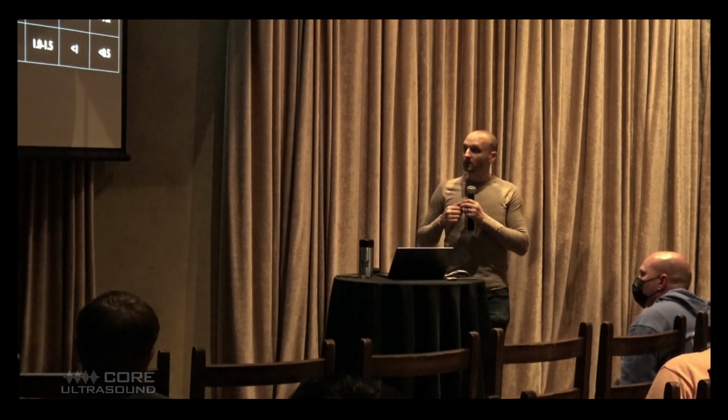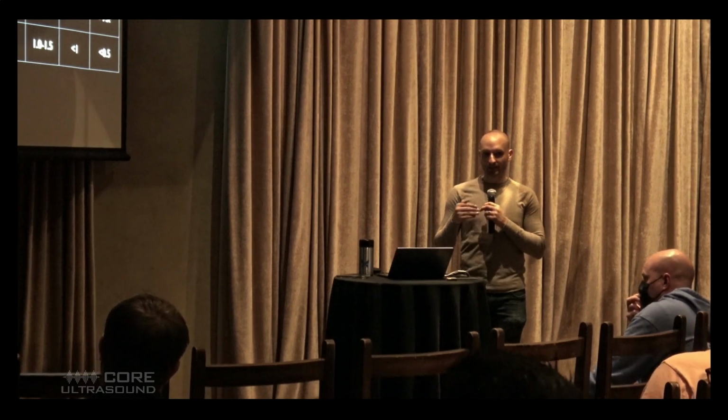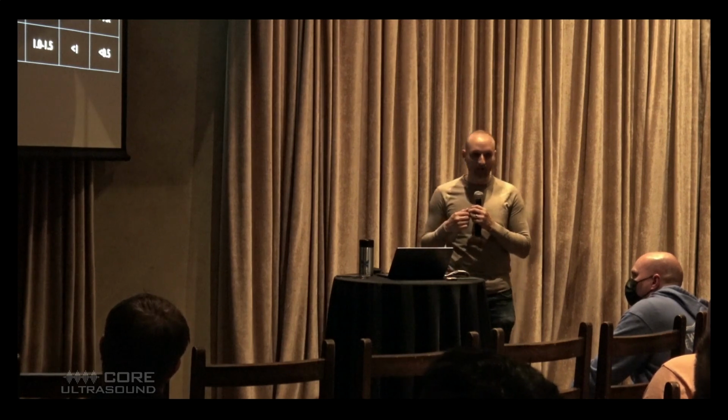The pulse gates right before the valve opens, I guess, if you're doing the pulse wave Doppler. But with continuous, it wouldn't pick up really high velocities if you're doing the pulse wave. So that's why you use continuous. Yeah, the continuous one is better at higher velocities. So if you have a high velocity system, it's usually better to use continuous wave Doppler. Yeah.